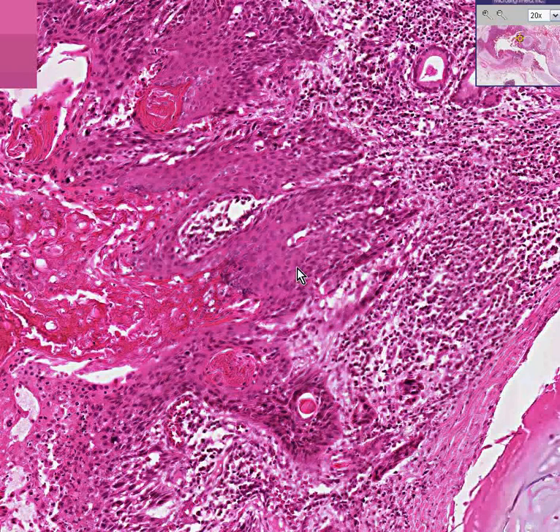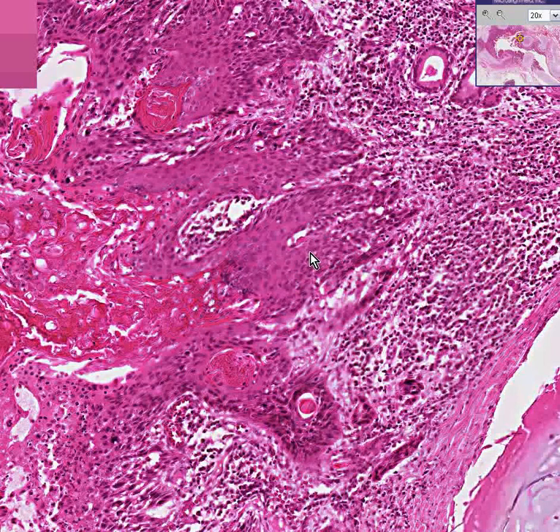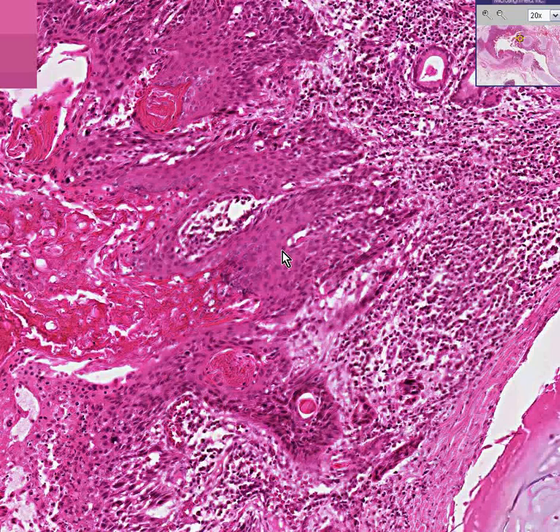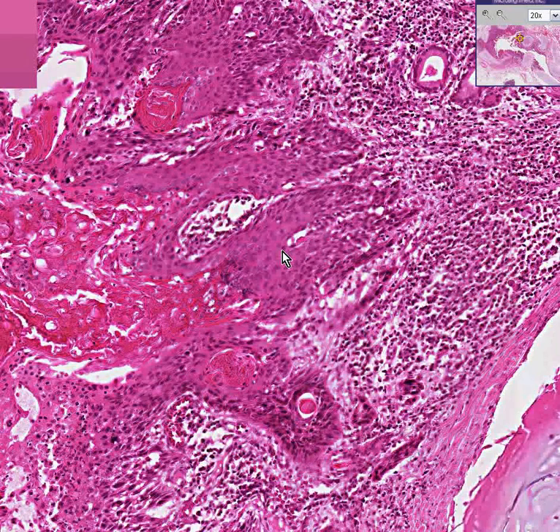I wish I could find bridges there in the little clear spaces between tumor cells — they look like little steps in a ladder. If you didn't see bridges and didn't see pearls, and all you saw were nests of cells that kind of look squamous but not very much and certainly wouldn't be forming glands, then you could call it poorly differentiated squamous cell. Sometimes a poorly differentiated squamous cell might be called an undifferentiated large cell if the pathologist thinks it's not differentiated enough to even look squamous. Quite frankly, they behave the same way because they are the same — large cell carcinomas probably are poorly differentiated squamous cell carcinomas.